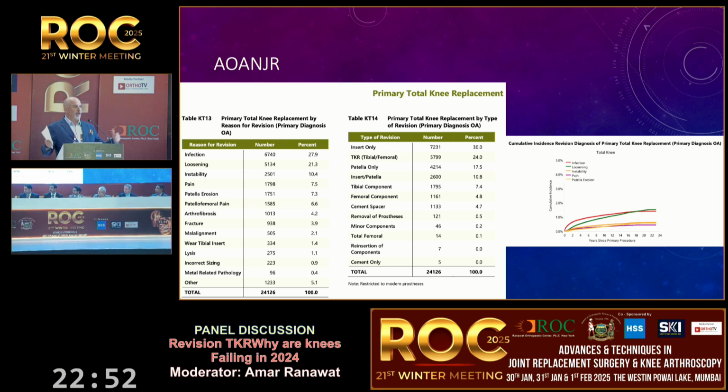and your room. And so, are you guys all cementing all three parts at once, or both parts at once? All at once. All at once. Right. Great. So, I think the ability to have proper cement technique... tell me what's one of the problems of doing compression technique like you described, and how that can get you into trouble.